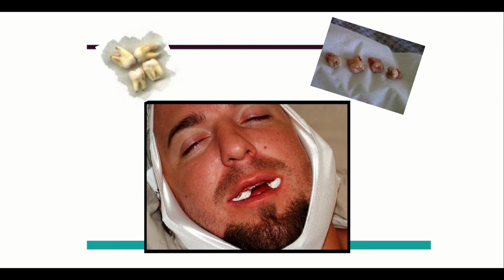And here's what we look like after those wisdom teeth extractions. Now notice that these teeth are actually fairly small. Even though having wisdom teeth removed can be quite painful, and it feels like a huge hole in your socket in your mouth, they're actually typically fairly small.